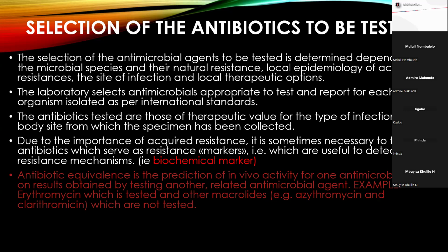There are some scenarios where disc methods don't work. An example is vancomycin on Staphylococcus, which doesn't have breakpoints, so only MIC is acceptable. So the test method also determines the selection of antibiotics.